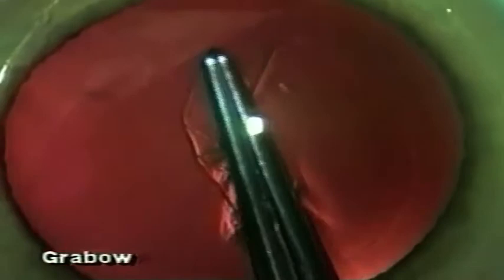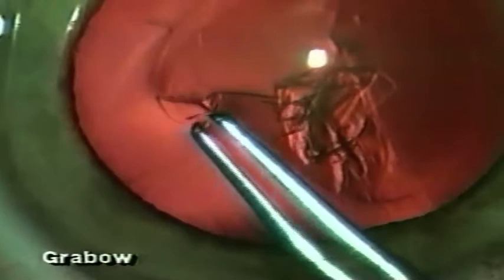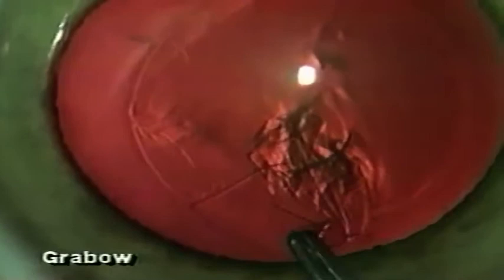The capsulorexis is done under Helon in most cases in several stages, making sure to turn the anterior flap over on its back and using the flap itself as a guide to try to make the capsulorexis as circular as possible, although that is not really necessary as long as the rexis is continuous.